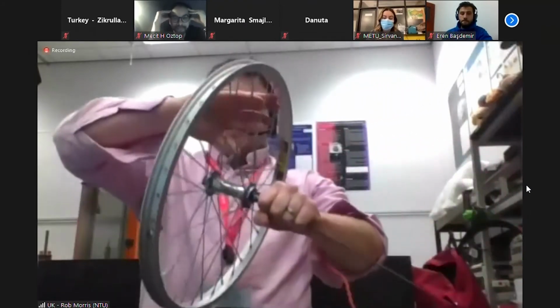Now that motion is exactly the same thing as we see in protons. So if you have your protons and they're beautifully aligned with your magnet, as they lose their energy to the system, they keep their angular momentum, but as they lose their energy to the system and exchange their energy, it relaxes back to equilibrium. So that's what we would normally call T1 in an NMR experiment. Okay, so it's the same thing that we're seeing.